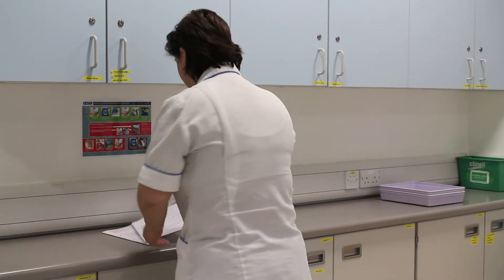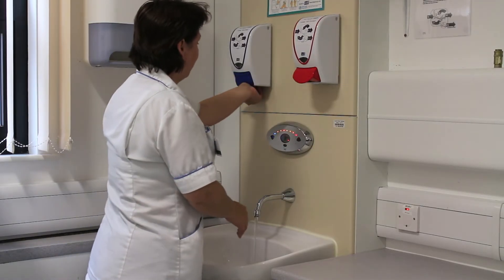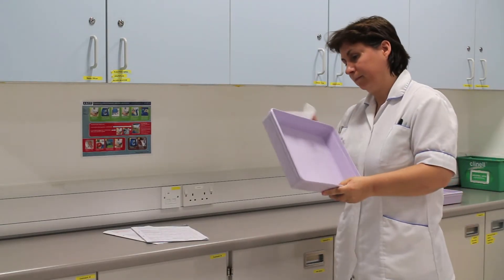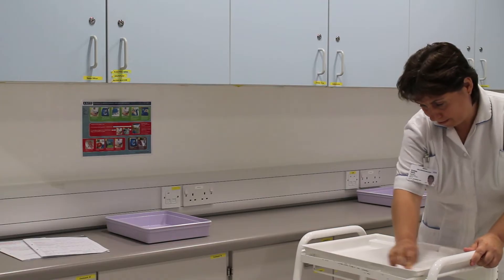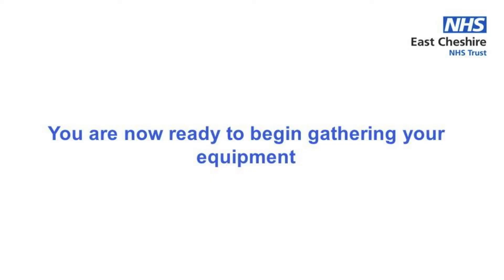Once you are satisfied with all of these checks, enter the area you will be preparing the infusion in and wash your hands thoroughly with soap and water. Select a visually clean tray and clean all sides with wipes containing a detergent and a disinfectant, and whilst the tray is drying use the same type of wipes to clean your trolley. You are now ready to begin gathering your equipment — don't forget to check expiry dates of items as you do.